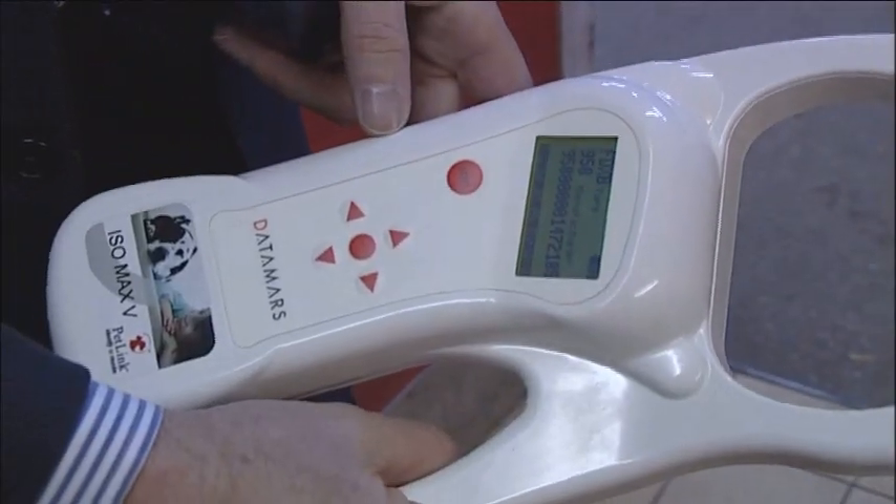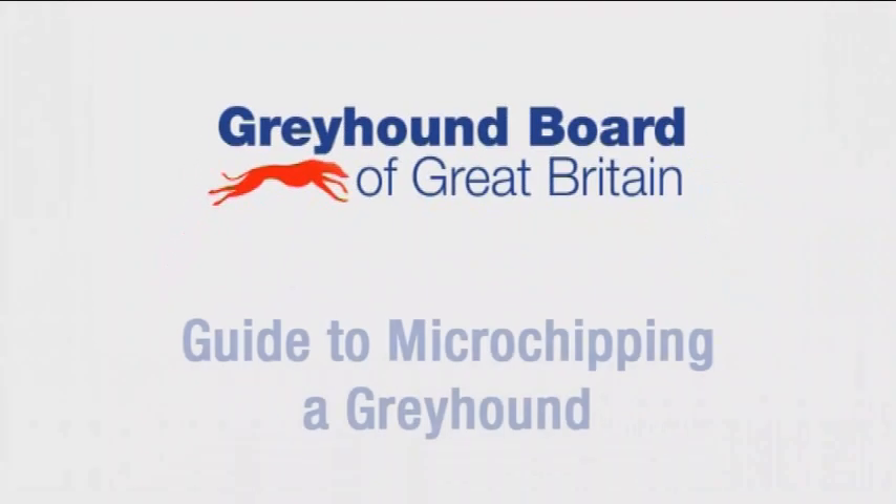It is the least likely to migrate when inserted by a vet. This short film will provide a quick and easy step-by-step guide to using the Datamars microchip to implant into racing greyhounds consistently and to Greyhound Board recommendations.